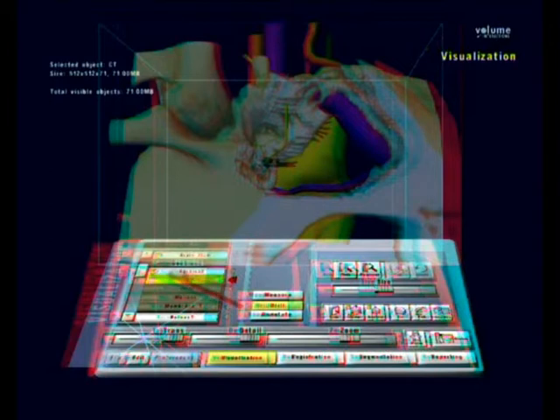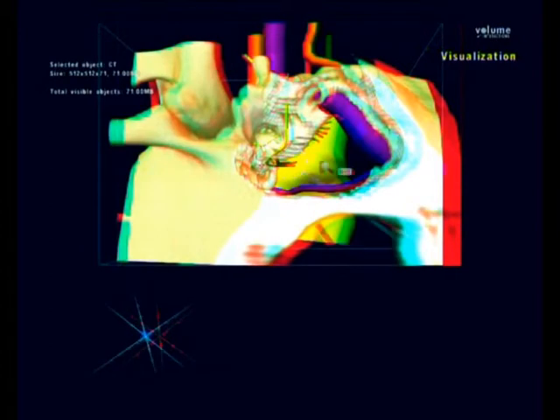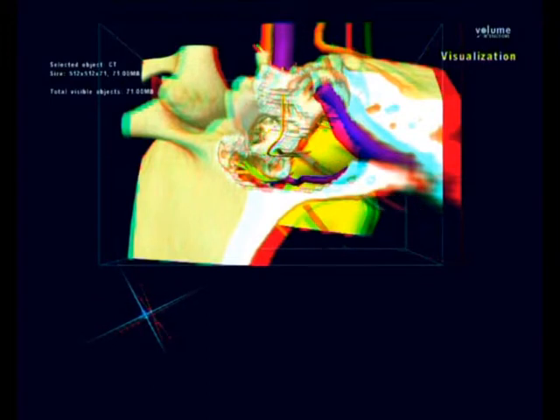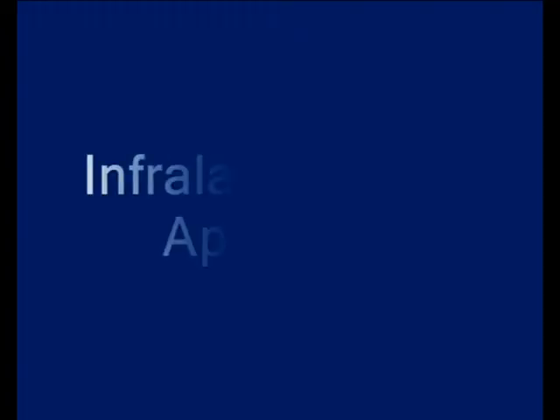And the cochlea removed. The facial nerve is now completely skeletonized and exposed. In a classic transcochlear approach, the facial nerve is transposed, but we have left it intact in its original location here. The petrous bone is now drilled very anteriorly to expose the internal carotid artery in its vertical portion.